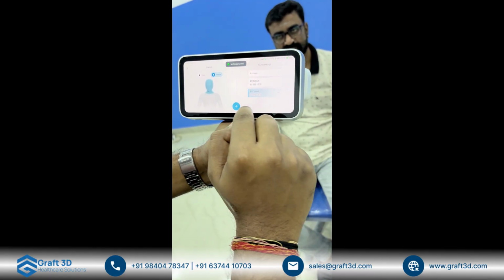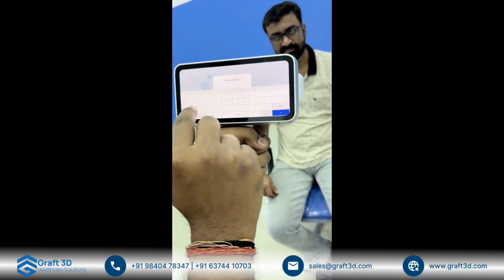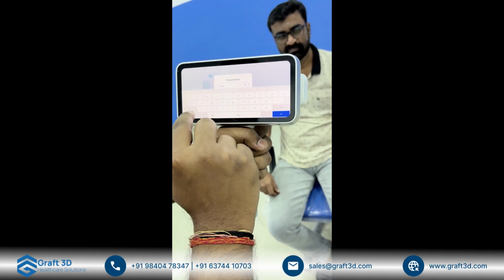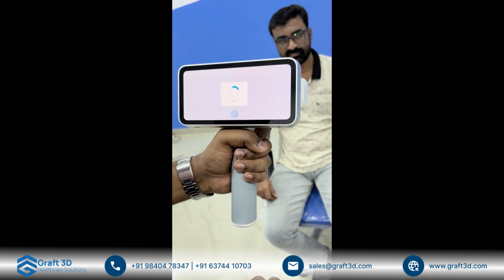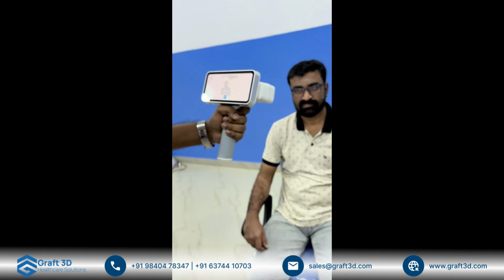Once I save this, I have to click on the next step. It will ask me the project name. I'll put the project name as facial scan. Done. Now over here, you can see the preview. This is what the preview looks like.